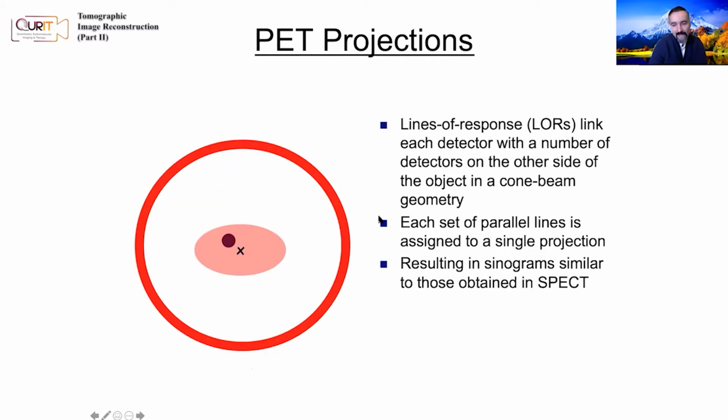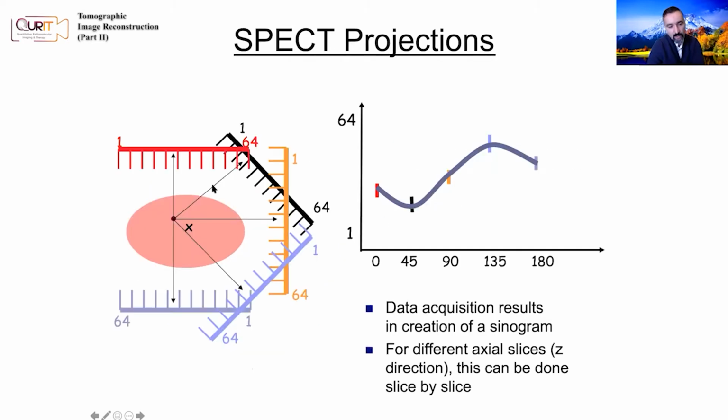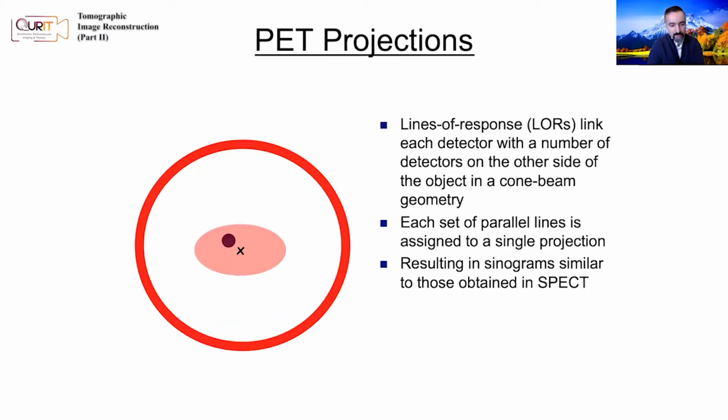Now in PET, it's a little bit different, because in PET you're not rotating cameras around the patient. Also in some novel SPECT designs, as we've talked about before, like pinhole designs, you're not rotating the camera around the patient. It might be stationary, or it might be sampling the patient in a different way. But the point is, no matter how it is, you can always generate sinograms.